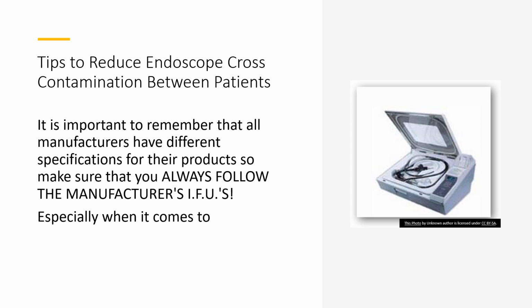Like I said, it's very important to remember that all the manufacturers of endoscopes have different specifications for their products. So you need to make sure that you are always following the correct manufacturer's IFUs. Again, if you don't know what IFUs are, they are instructions for use. Instructions for use are always available to you in your sterile processing department. If you do not know where they are, please talk to your manager, because they are available to you, I promise you.